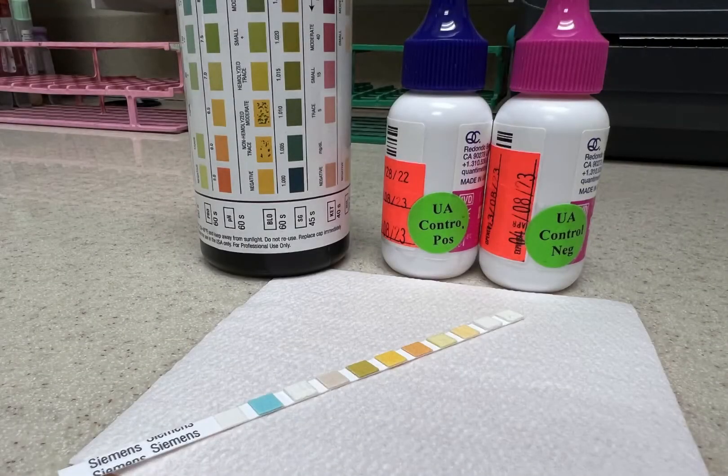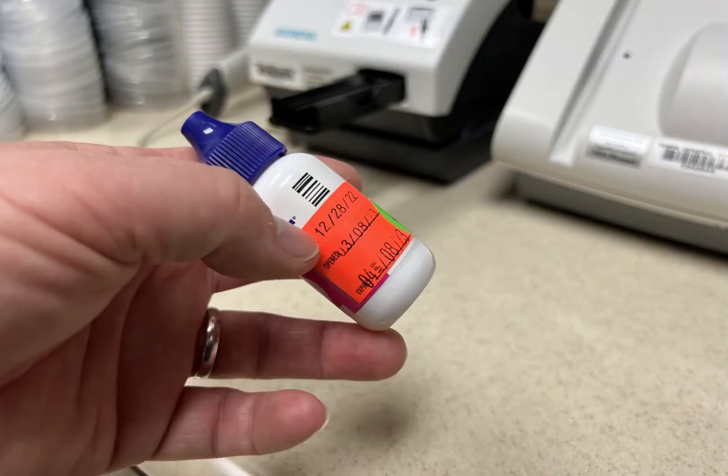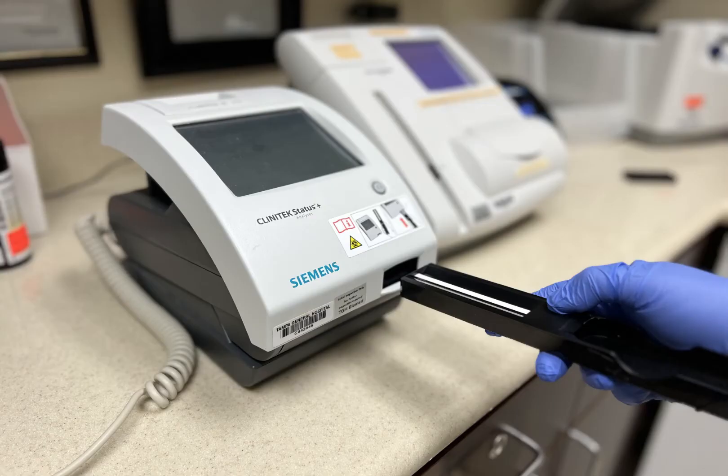How to QC the urinalysis strip meter. It is very important to check the expiration date on the strip and the controls. Clean the bridge before performing a urinalysis quality control.